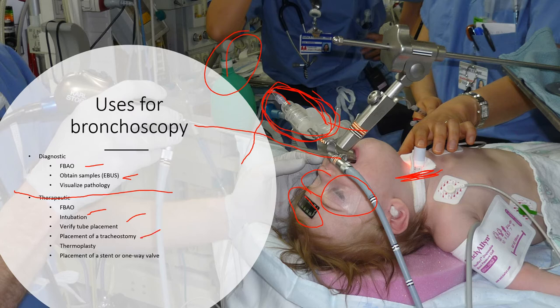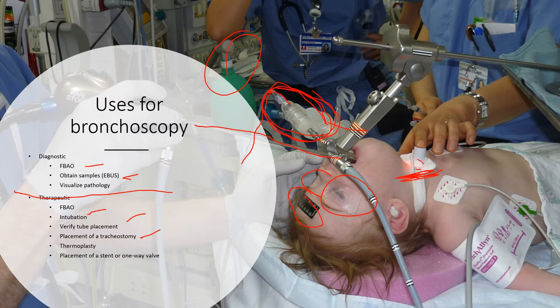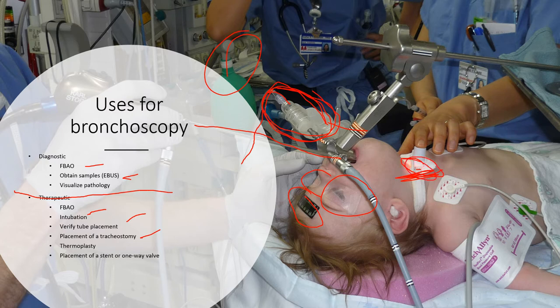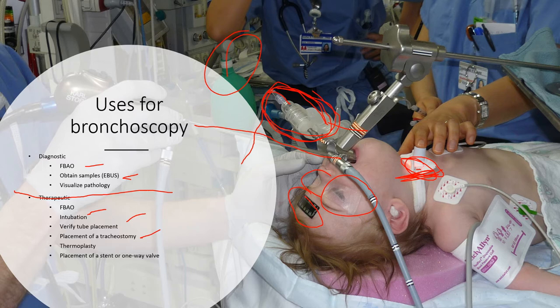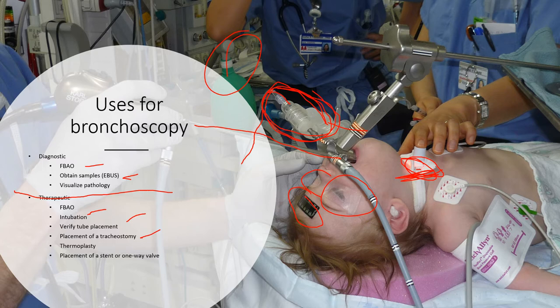When placing a percutaneous tracheostomy, we actually use the bronchoscope during the procedure. You can see the light at the kid's trach — you can see if the trach is centered or angled left or right, like a 1 o'clock or 11 o'clock position. We use it to make sure the tracheostomy is going in at the right angle, at the right spot in the airway, and to monitor the airway during the procedure.